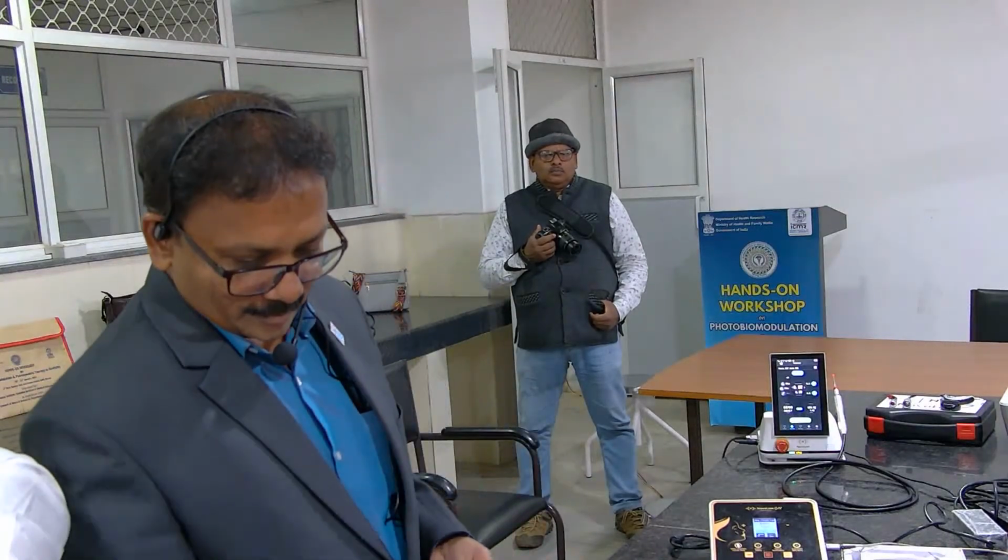Whenever there is infection, bacterial, viral, or fungal, use a dye. When you want only the cellular modification or biomodulation, no need of any dye, right? All good.